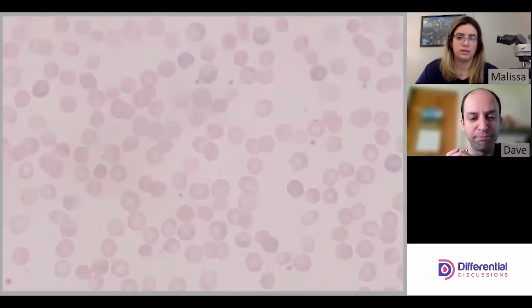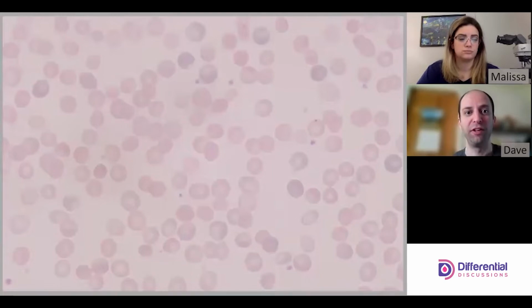Yeah, and I think the number of spherocytes, and accordingly the number of polychromatophilic red cells, will depend upon the severity of the HS that the patient has. That's a good point. So here we have a lot of genotypes for this particular spectrum of phenotypes, right?